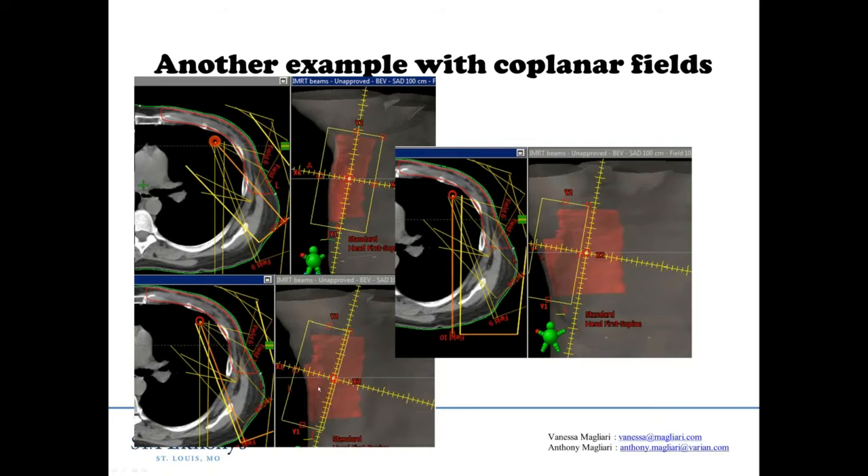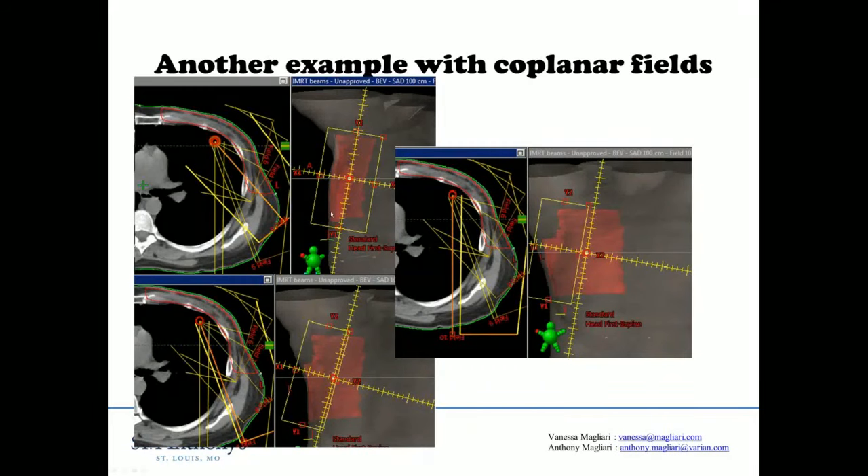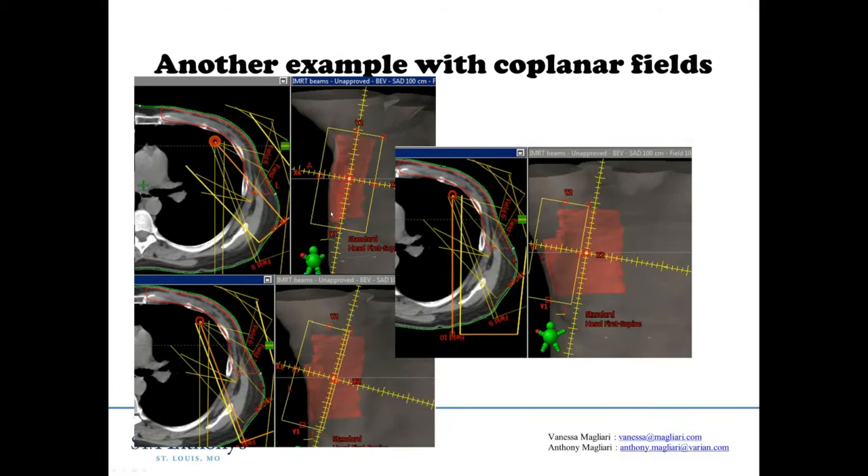So here you have it. The reason that static fields in my mind are at least at this time superior to VMAT is because I can pick the ideal collimator rotation for each of these beams. With VMAT, you're stuck with one collimator rotation throughout the arc. You can see that we're always picking a beam to keep the jaws as small as possible every step of the way.